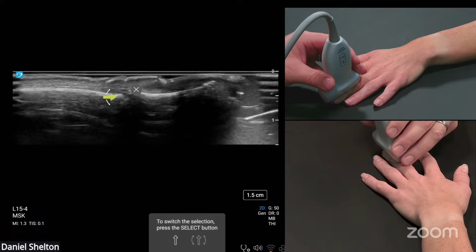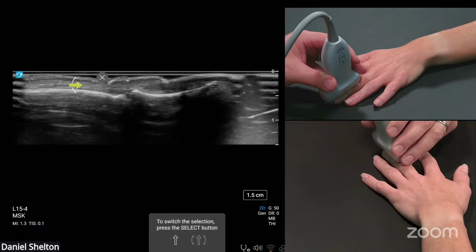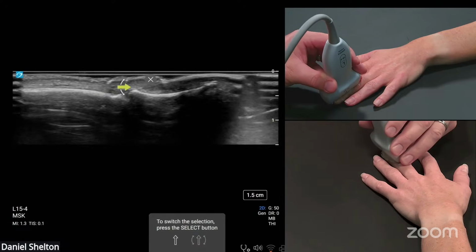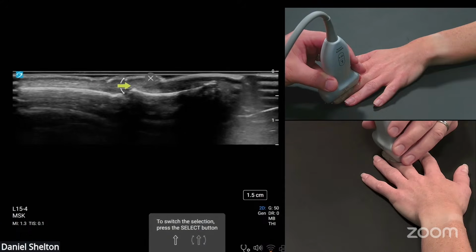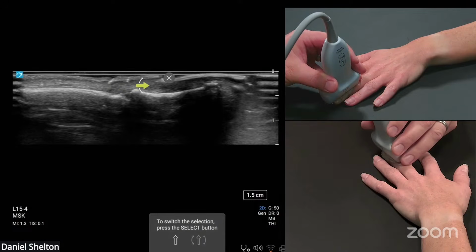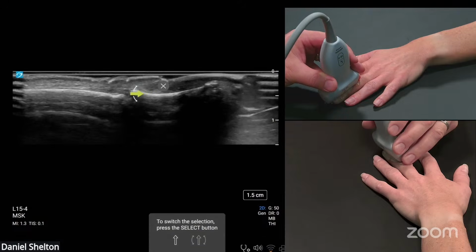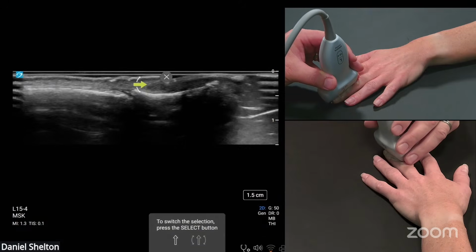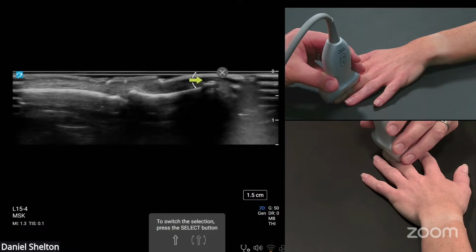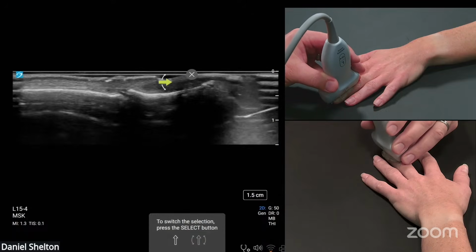We've got the DIP joint, and then we ended the extensor tendon exam with that extensor tendon climbing over the DIP. So we see the joint and the recess here. And then I can see the tendon somewhat attaching here a bit, but we know from the slides there's a bit more anatomy to look at here. So there's fibers that jump from the extensor to the nail root, which we'll be evaluating at 46 megahertz a little bit better, but I want to see what I can see. So it's important if you're looking at this nail bed to make sure your fingernail image is as reflective as possible.